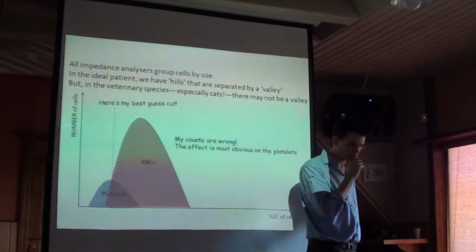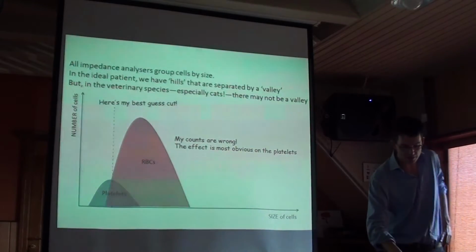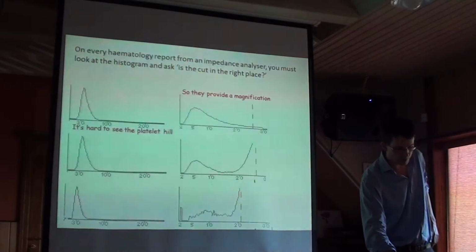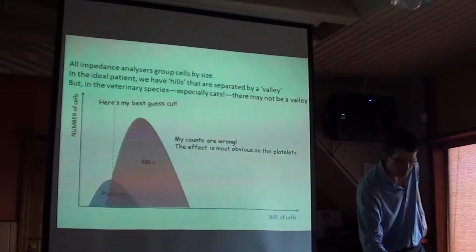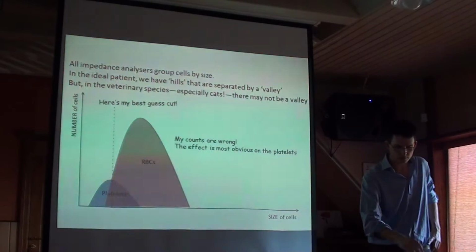Hulk verelistakutest on loetud tegelikult punasteks verelibledeks. We've missed some of the red blood cells. Ja osad punastest verelibledest on tegelikult loetud siis verelistakuteks. But the effect will be much less obvious. Aga palju vähem, palju halvemini ilmneb see siis nendel järgmistel graafikutel.